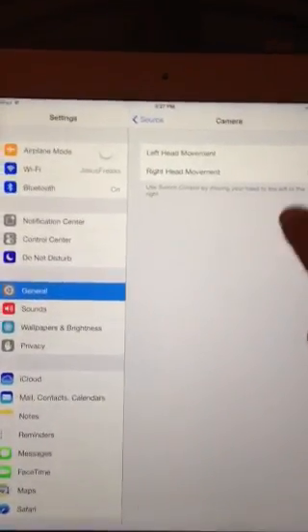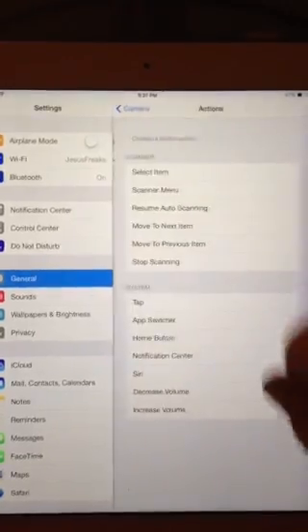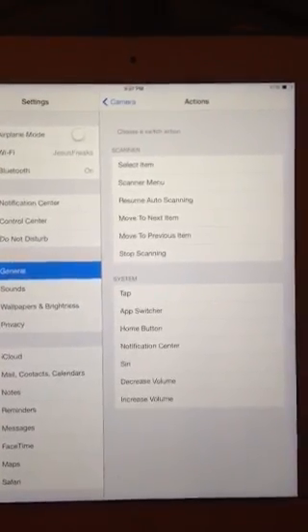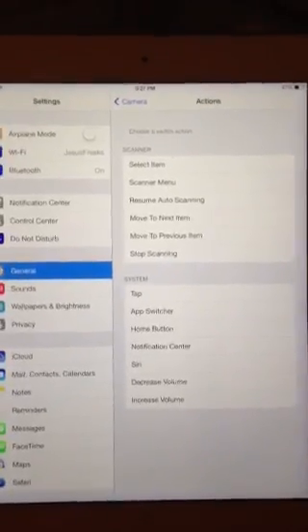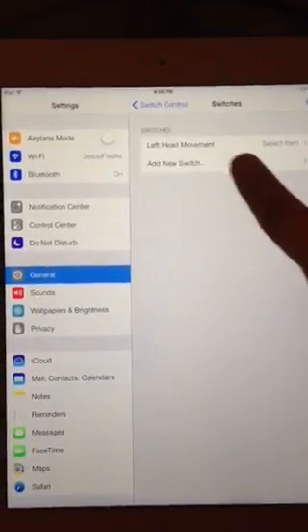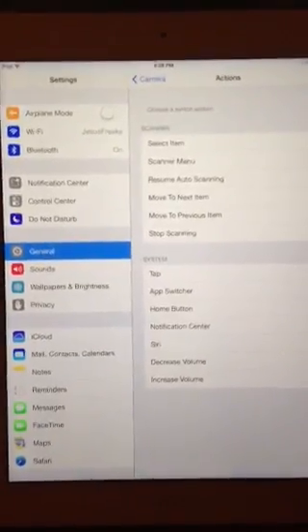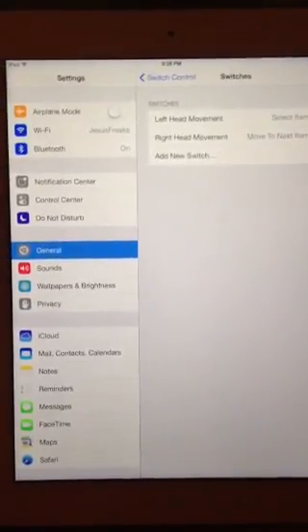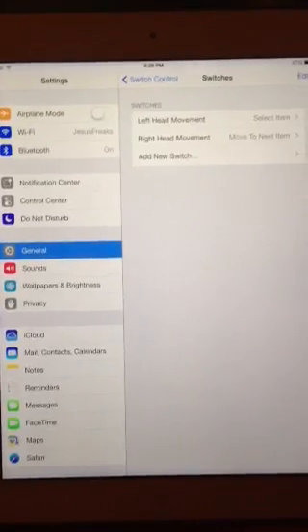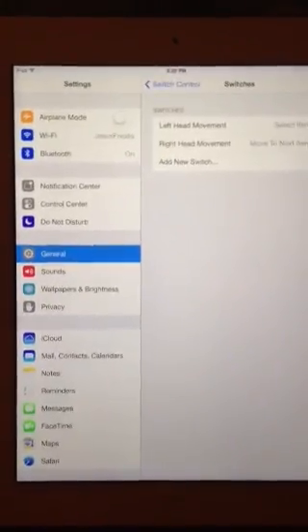We're going to go to Camera here, and you can either pick left head movement or right head movement. I'm going to pick left head movement. It's asking what you want it to do when you move your head to the left — I chose for it to select the item. Then for right head movement, you can have it move to the next item. So moving your head right advances the selection, and moving your head left selects it — like two-switch scanning.